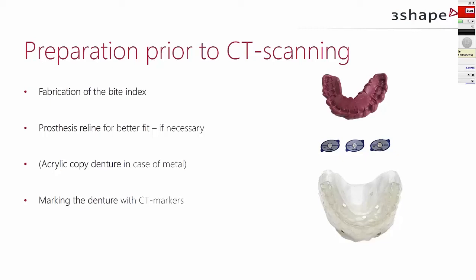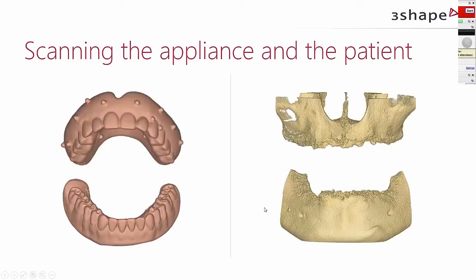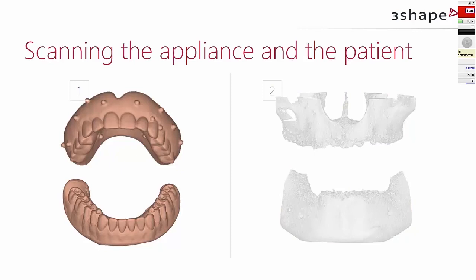Good. Perfect. So now the next step is to take the scans. So how are we going to do that? Yeah, so taking the scans, we also have some user feedback and input here we want to share, and it comes from both very experienced users but also users that are just getting started with this protocol. What we hear from both user groups is that you always want to scan the denture first. You want to make sure that you can get a good denture scan with your prepared denture with markers, and then you can scan the patient afterwards.